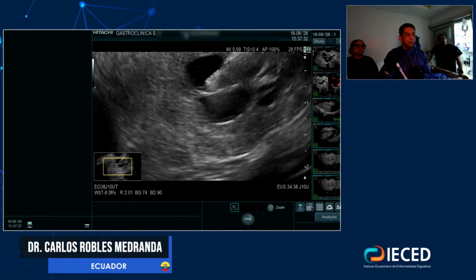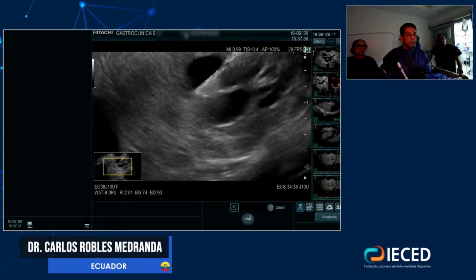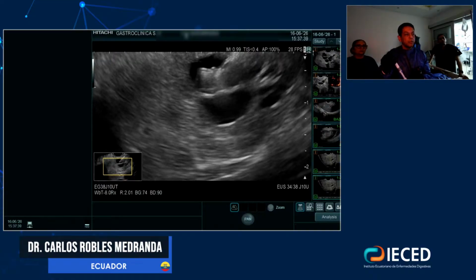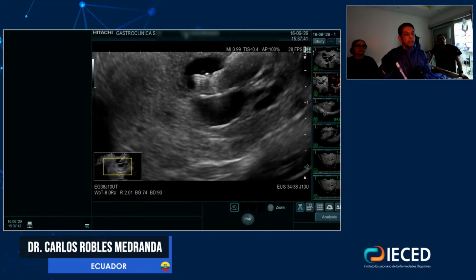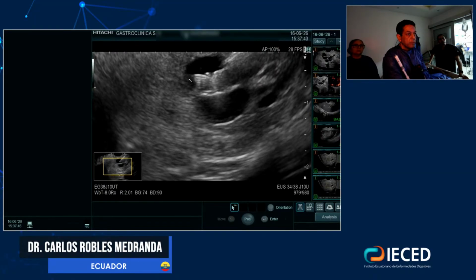Okay, open. One moment. Close. One moment. Open. So you see, now it's open. It's completely open. I will show you here, okay? This is open, this is my needle, and I am inside the cystic lesion.